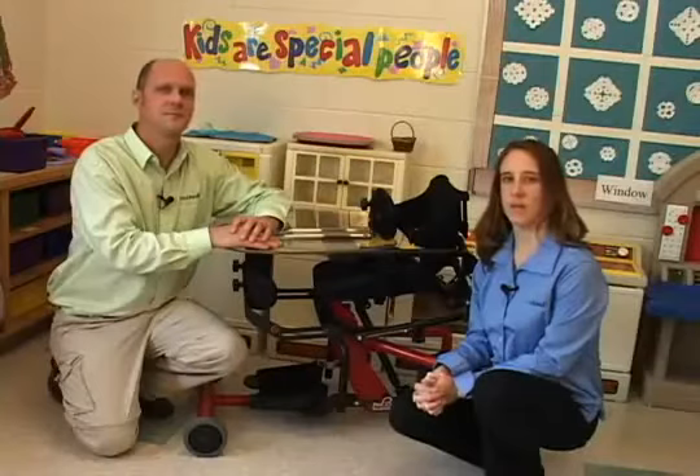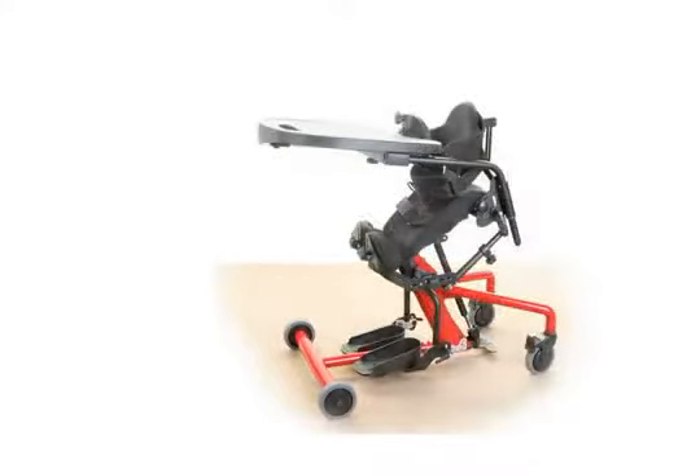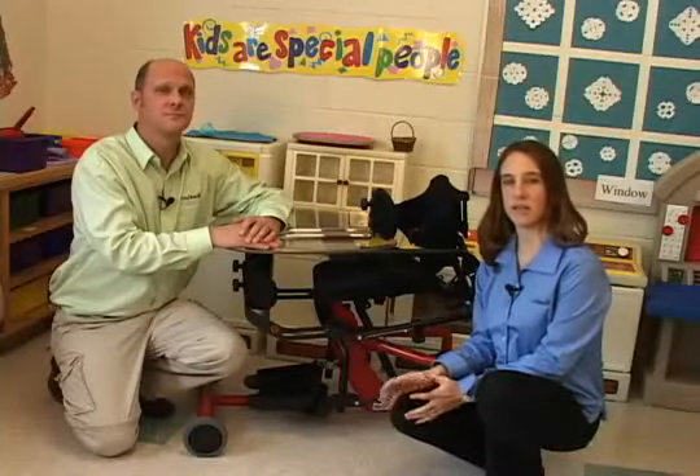The Bantam is a versatile pediatric stander that is easy to adjust. It can go from a seated position to anterior tilt, supine standing, upright standing, and everything in between. Now you have everything you need in one stander, the Easy Stand Bantam.